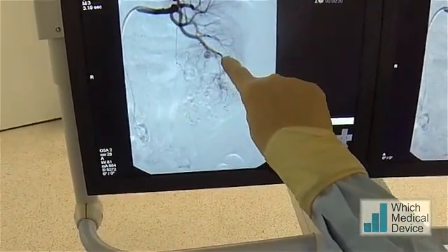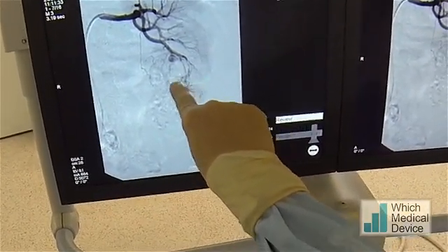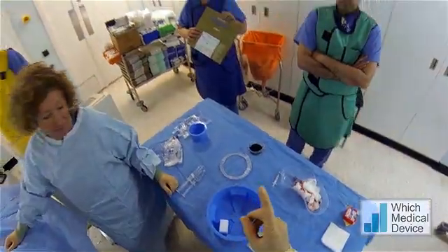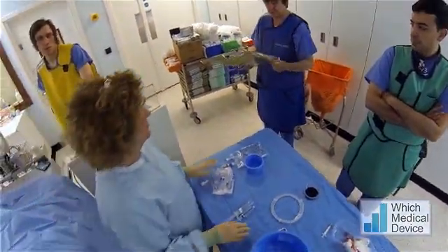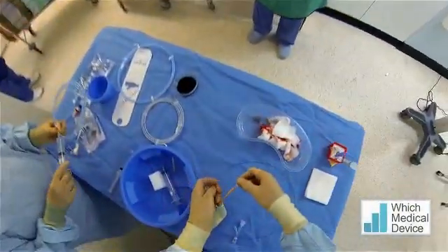What I'm going to try and do is put a microcatheter right down distally, and then inject some Onyx so it'll come back proximally, taking out these branches and the aneurysm. Can I have the 2 French Prograte with a single angle GT wire? I need to know what the dead space of this Prograte catheter is.